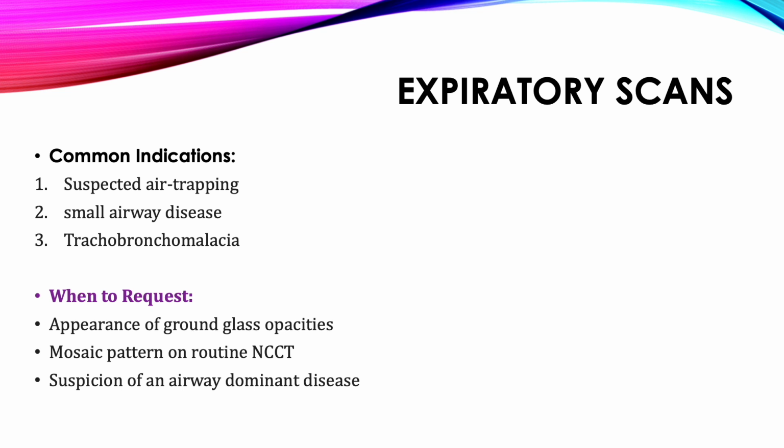Now, basically, if you do sequential stepwise, you can just concentrate on doing the expiratory images for areas where you suspect a problem. So there's less radiation. So we prefer sequential stepwise rather than the whole volumetric. But if it's an elderly patient, he cannot breath hold, then we do it in a contiguous phase.